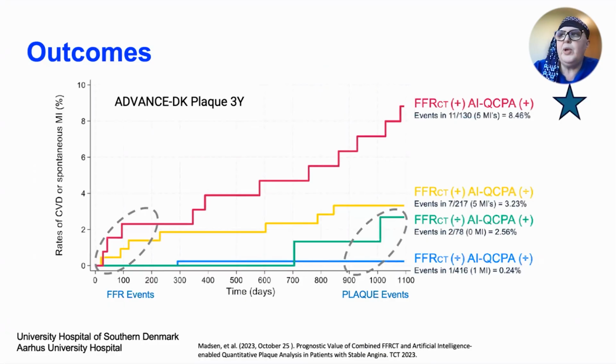But even when you go to the cath lab to fix that FFR that's positive, and you say to your patient, you've been stented, you've been revascularized, you just need to continue medical therapy, it's still very important to look at the plaque volume, because how we frame our response to patients can be very important downstream for them.